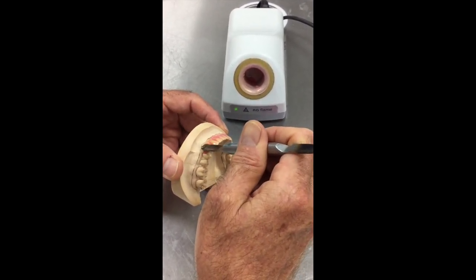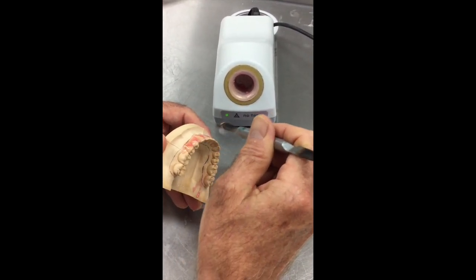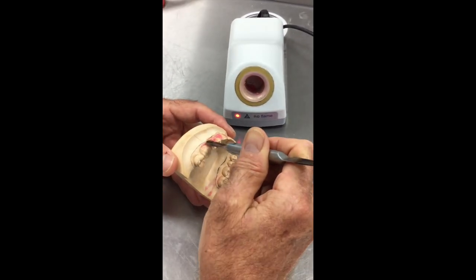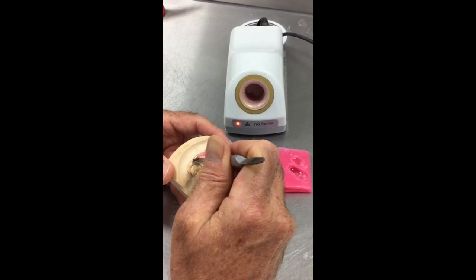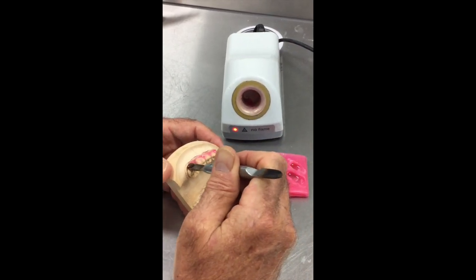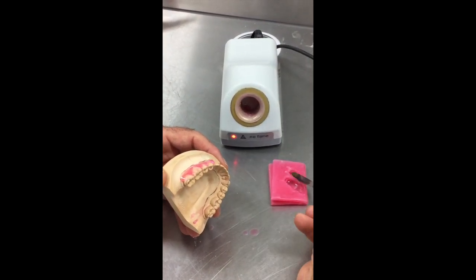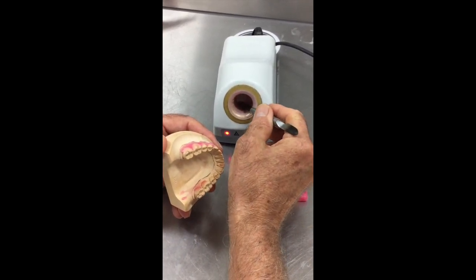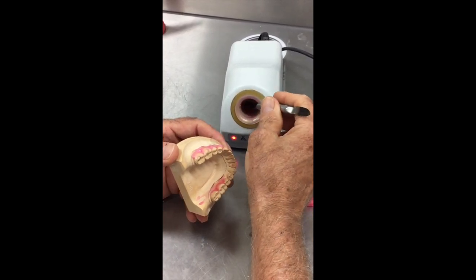Now, if they're retroclined or proclined teeth across the arch, obviously we're going to apply a little bit more than less so that we don't have a problem with taking this out of the mouth, because some of the impression materials can be quite resistant to tearing through the interproximal, and we don't want to put the patient through unnecessary trauma. So if their undercuts are a little bit more excessive than the standard that you're seeing on this model, then you're going to fill them a little bit more. But for the purpose of this exercise, you can just see that I'm applying this wax to fill up the undercut.